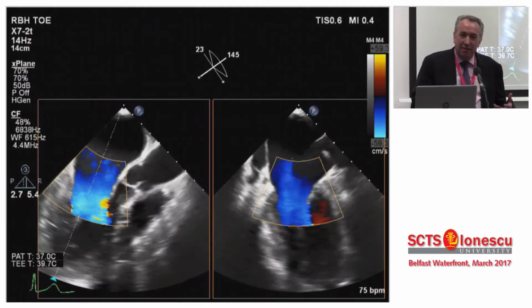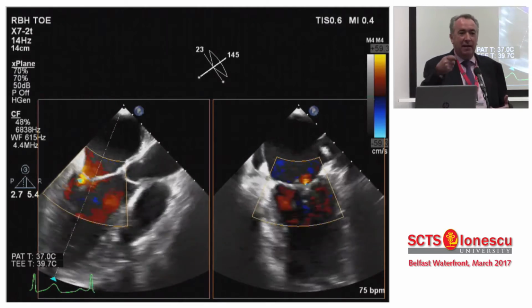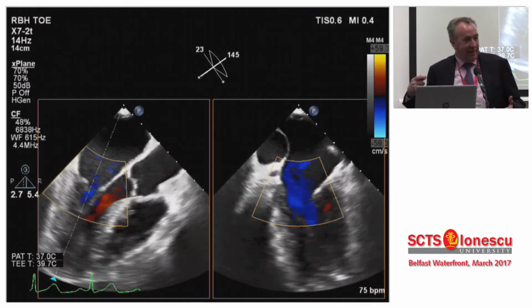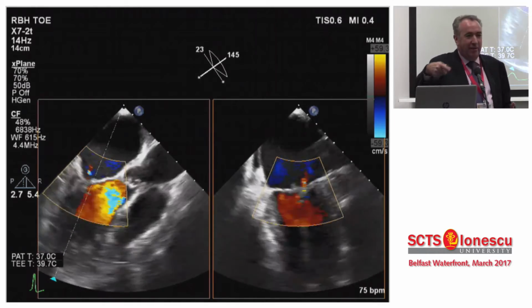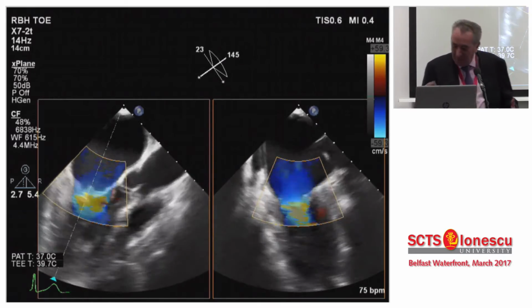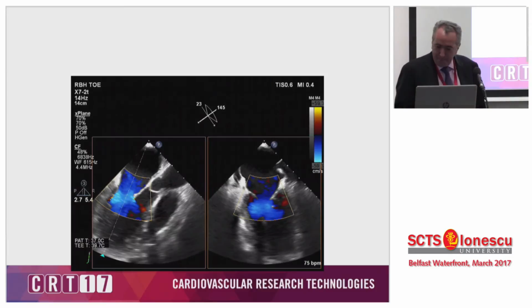One of the slight issues with this device is that it only will implant 1 cord at a time. So you have to put the device in, take it out, reinsert the sort of kind of 14 French device. So it's a little sort of ergonomically uncomfortable, but it does work.